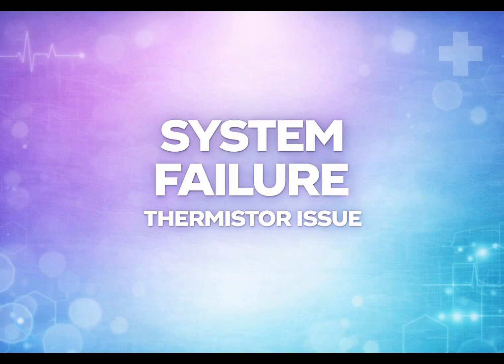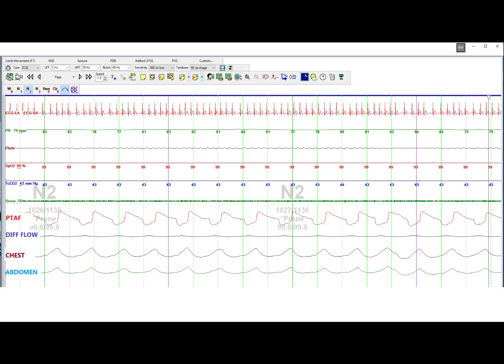Case number 3, flat differential flow signal. In this example, airflow appears flat. This may occur if the thermistor has become displaced from the tracheostomy ventilation port, or if the sensor is damaged, or if it is connected to the incorrect differential channel.